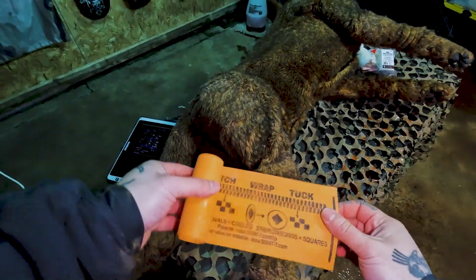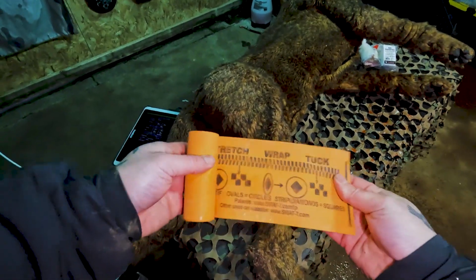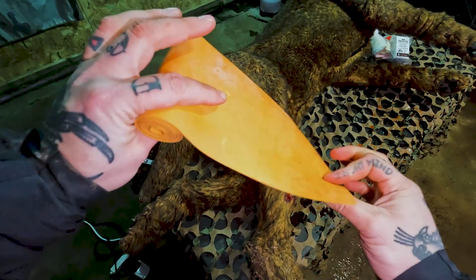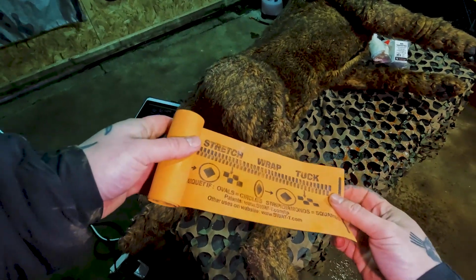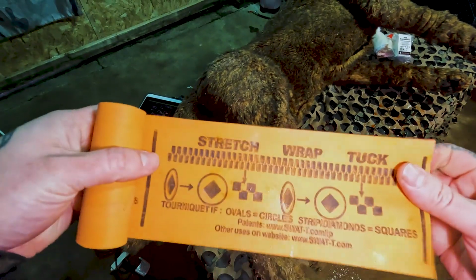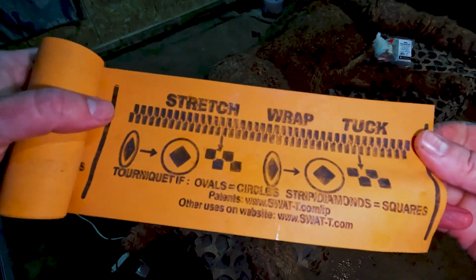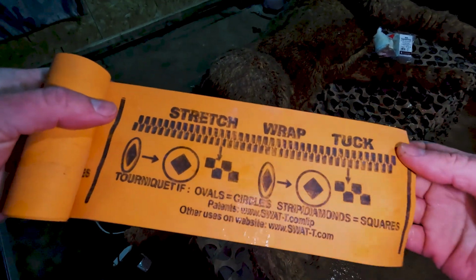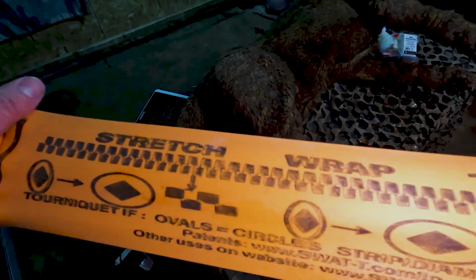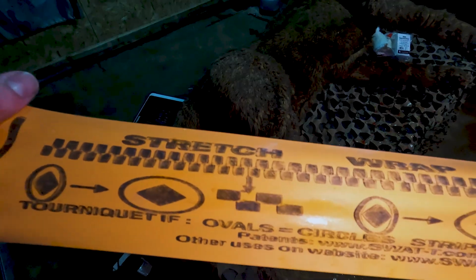So now I'll demonstrate the same thing pretty much, but with the SWAT-T tourniquet. And this is basically just like a big band you could do like PT exercises with. It has instructions on the front, making it dummy proof. So the idea is that you stretch the wrap until those rectangles become squares.